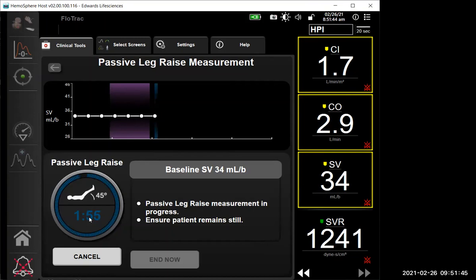Once I get with Julie, would you guys rather it be in person? I'm actually using my simulation, where we can look at different patient scenarios, whether it's cardiogenic shock, sepsis, or hypovolemic, and you can give them volume, pressors, things like that, and see how everything you normally look at changes.